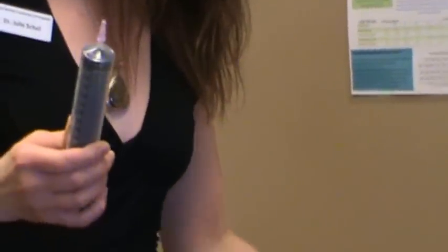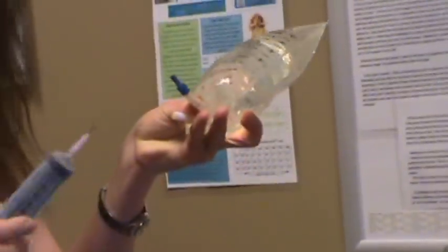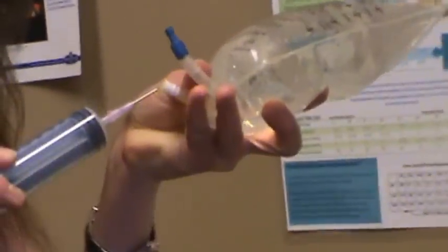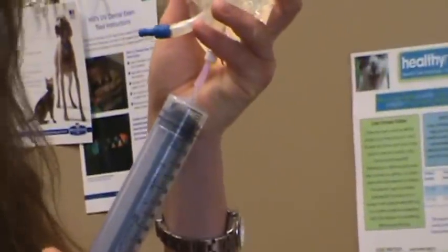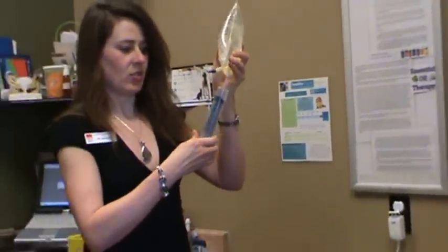Then what I do is undo the cap that the needle has to protect it. A really hard pull will disengage it but will keep that needle on. Then you take your bag of IV fluids and go right into the needle port — this rubber port that has a bullseye center I call it. It's like a nice little round center, so you stick it in there and if you're right-handed you hold the syringe with your right hand and the bag with your left hand and you just draw up.